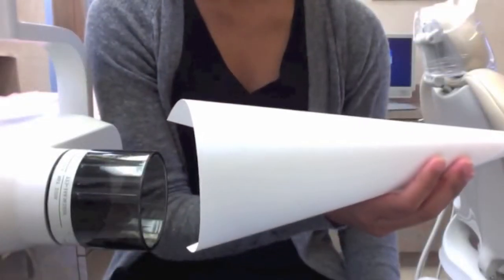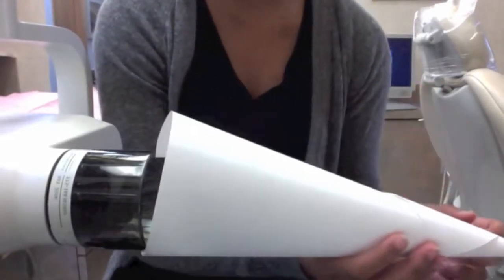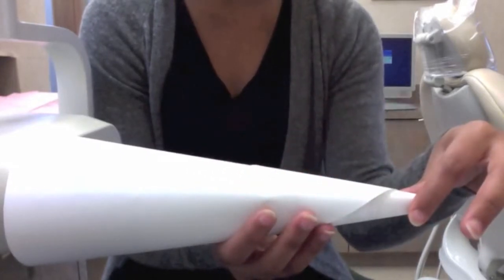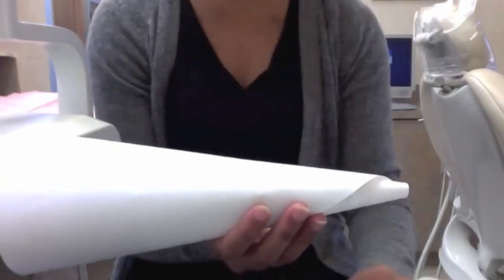So a collimator can come in two different shapes. It can come in either a circle or a rectangle. Before, they used to have a plastic cone-like collimator. It was shaped like a cone, and these weren't the best shapes because when the X-rays came out through the pointed end of the cone, they would produce excessive amounts of scattered radiation. So this collimator is no longer used in the dental setting.